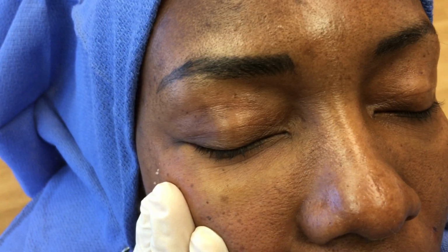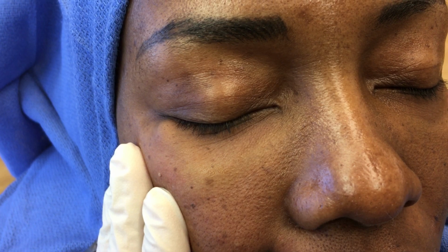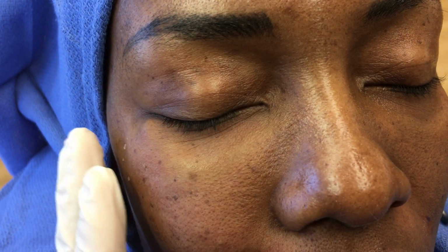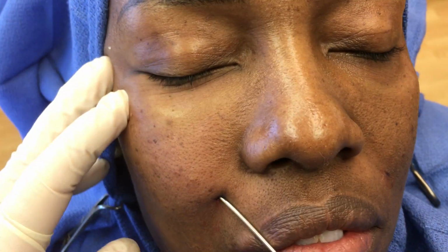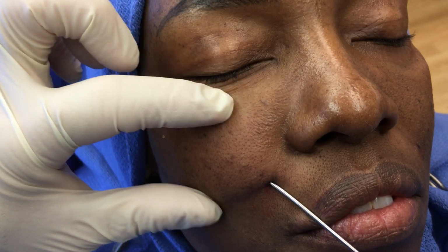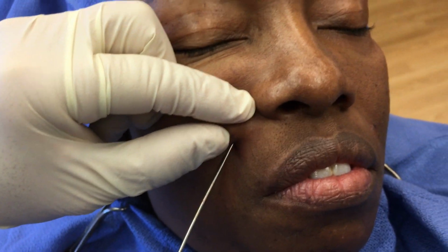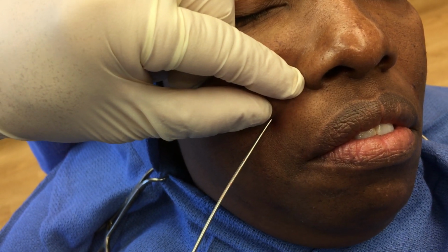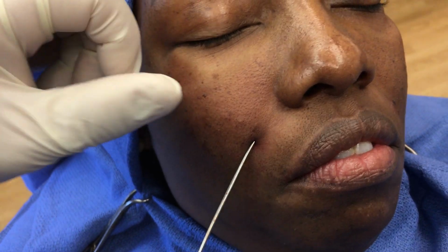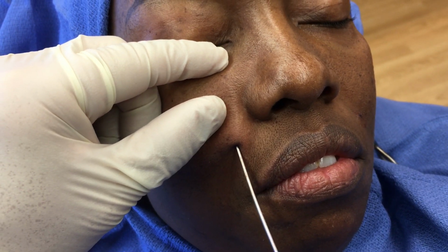Okay, so we're just kind of bringing it down into her lower cheek. What this will do, just like if we were to use filler, is this fullness up through here will bring her whole cheek up, because the skin will fill up more, and that will actually decrease the outline of this fold, which a lot of people hate. Also, we're going to put some right into the fold itself to soften that up. And so you can see she looks pretty natural, which is obviously the goal.